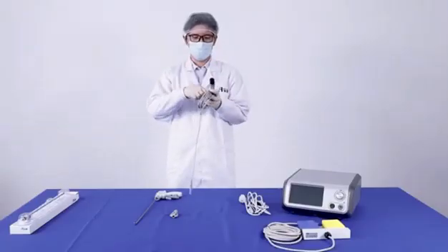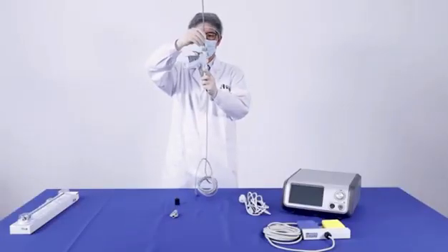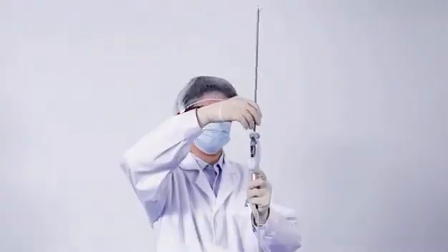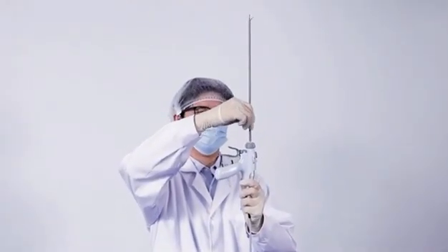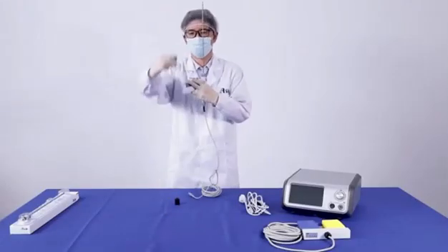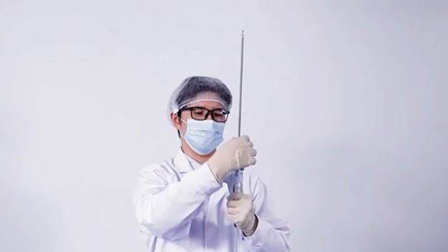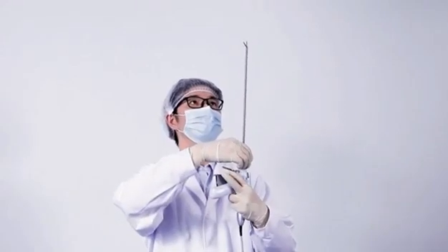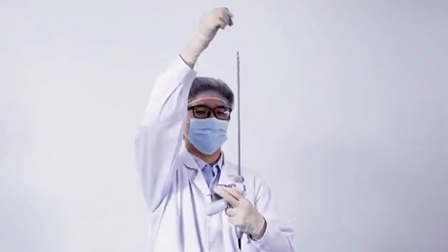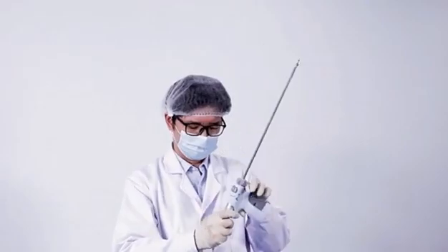Take off the protective cover of the transducer before connecting the scalpel. While holding the scalpel vertically, insert the transducer into the rear end of the scalpel by rotating the scalpel clockwise until it is tight. Slide the torque wrench onto the shaft. Turn the torque wrench clockwise while holding only the transducer until hearing 2 clicks. Close the trigger and remove the torque wrench. The transducer is now connected to the scalpel.